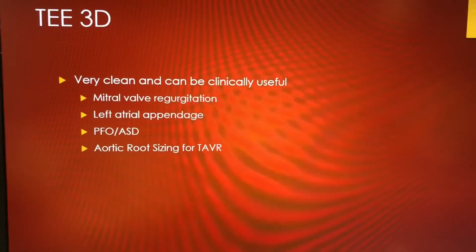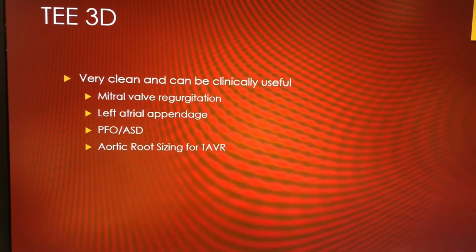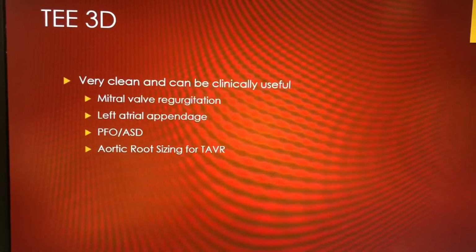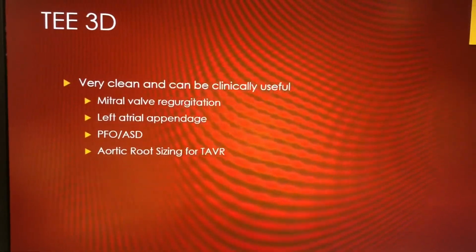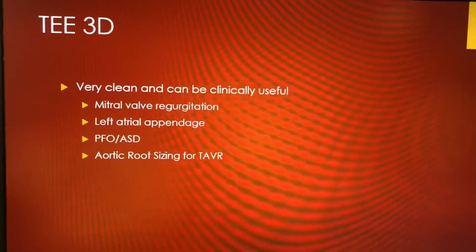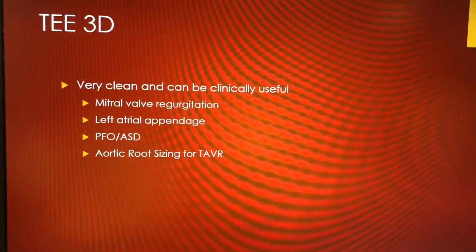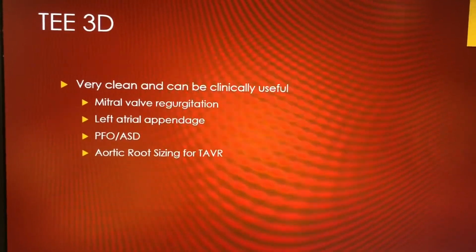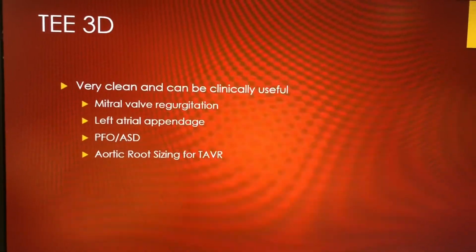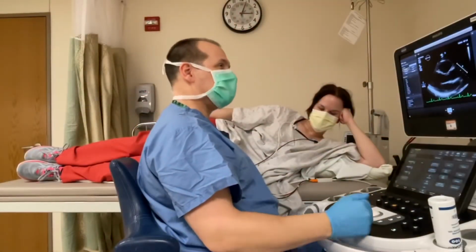So next up, we will show some live action pictures, some video of at first our transthoracic attempts at some 3D stuff, and then we'll move on from there. Once we get through a few basic principles, we'll move on to the 3D TE and look at those images and manipulate them and show different things that we can do to help give them some good answers. All right, first we're going to look at X-plane.